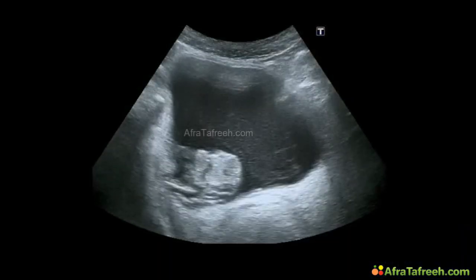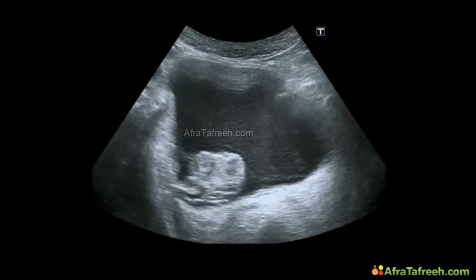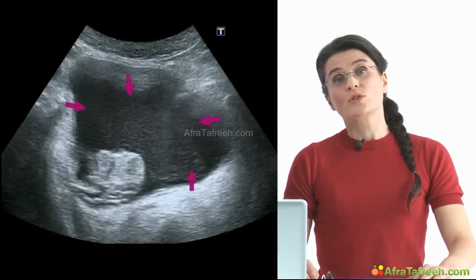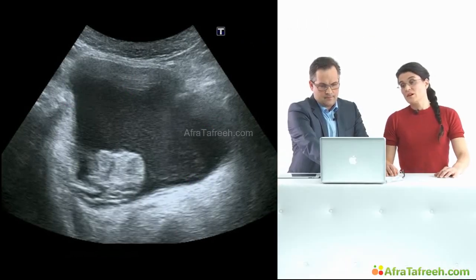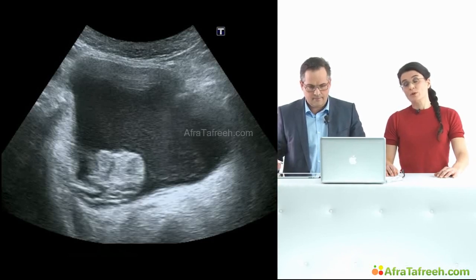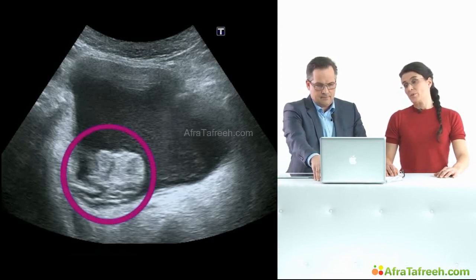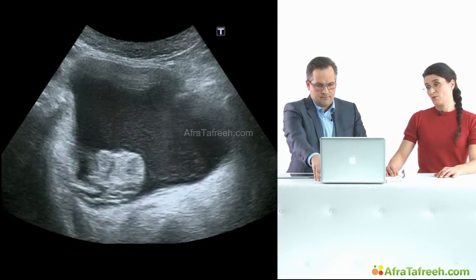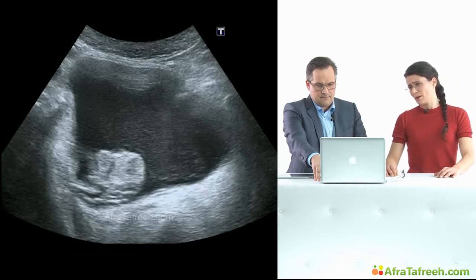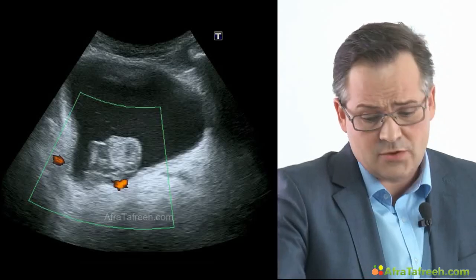We did a scan. Okay, we again can see a urinary bladder in here. This object contains fluid, which means it's quite dark. But we can see an object that should not be here. It's white, meaning it's hyperechogenic. It's round, and it's on the left side of the picture, somehow connected with the bladder wall. Exactly. And this should not be there.